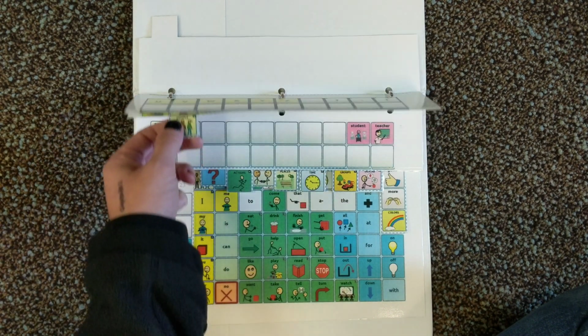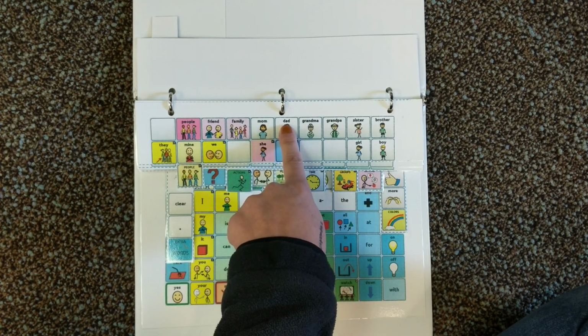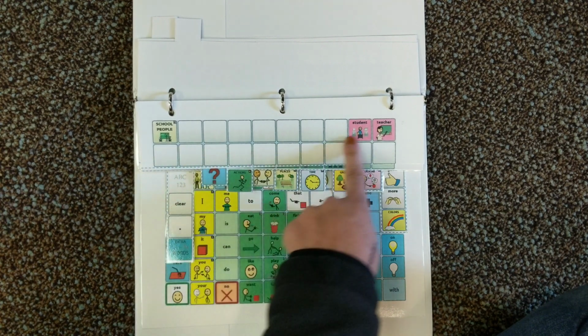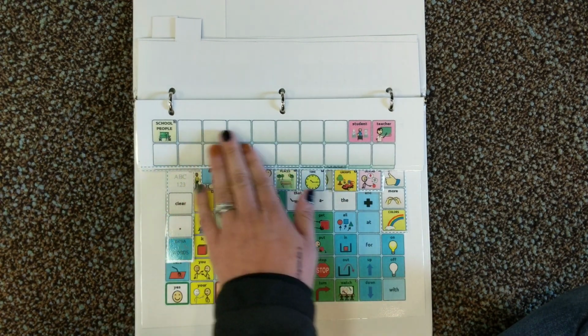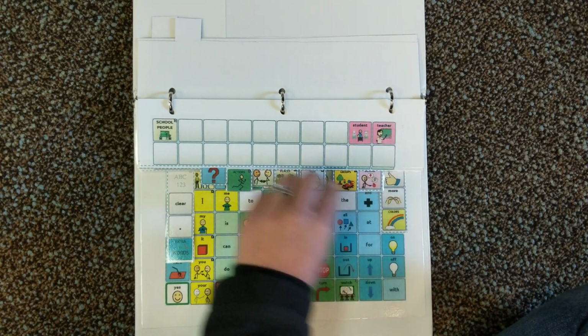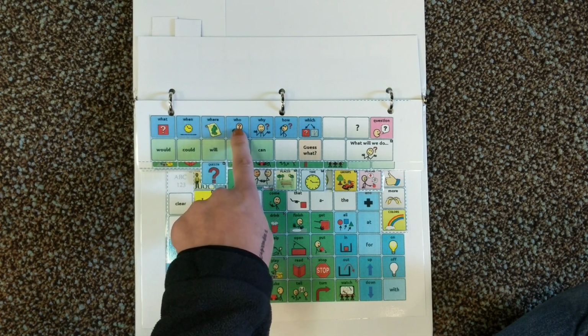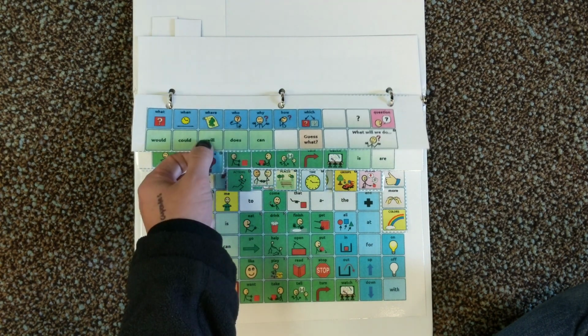So if you need to go to people, you would flip, and then you could say mom, dad, grandpa, and then there's school people. Normally the student's device would have all of their friends. So this one's kind of a little bit blank, but there's student, teacher. Then the questions tab has like what, when, where, who, why, how. So kind of like question words.